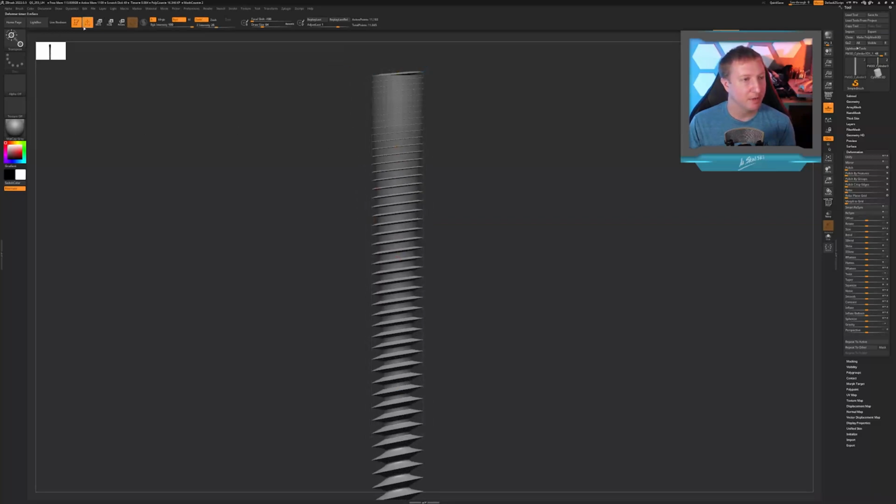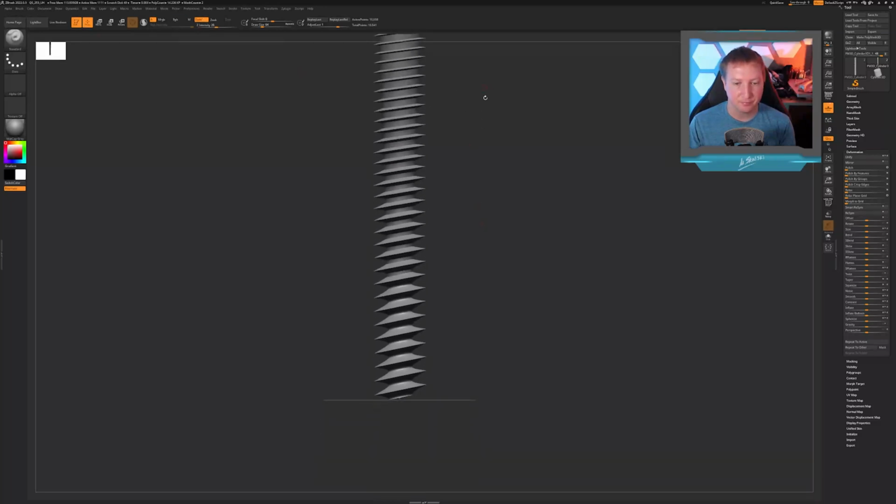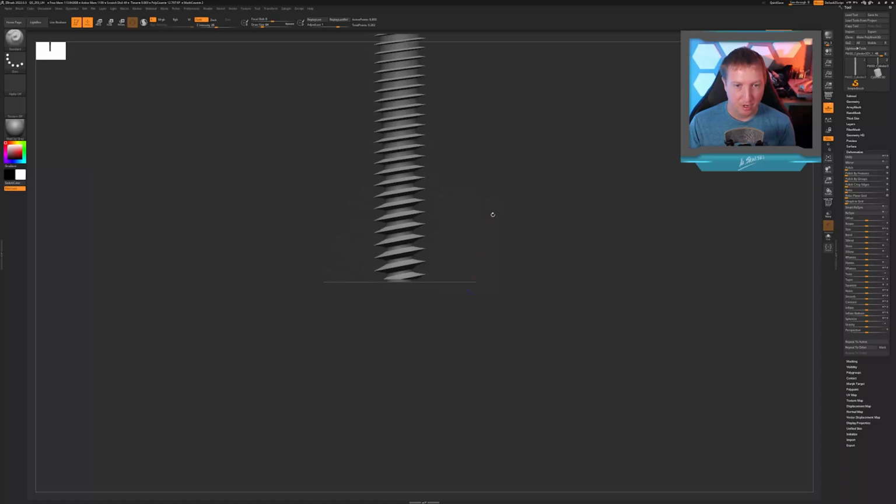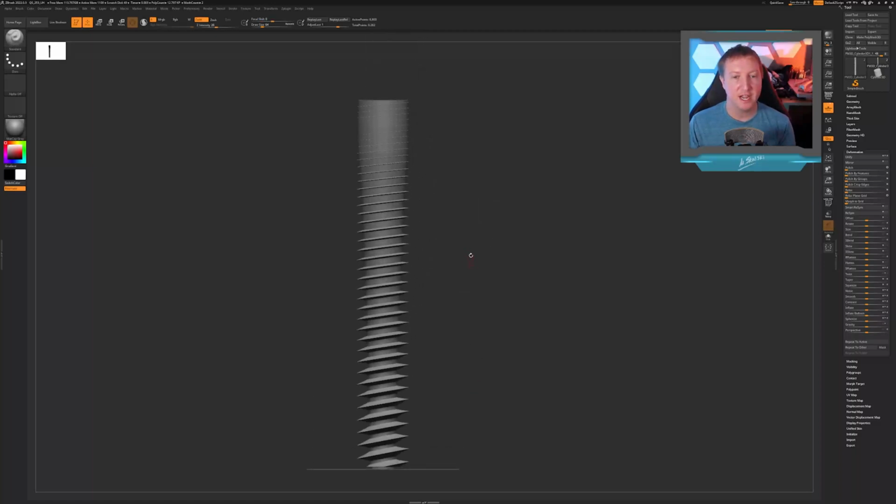All right, so let's come back here to our draw menu. Now let's just remove the excess here on either end of it. All right, that looks pretty good. Actually, let me just chop it there. Now what I need to do is add the cannula through the center of the screw. So first things first, let's merge these up.